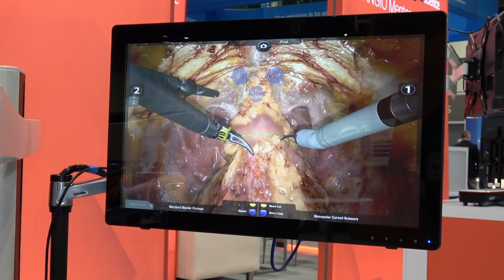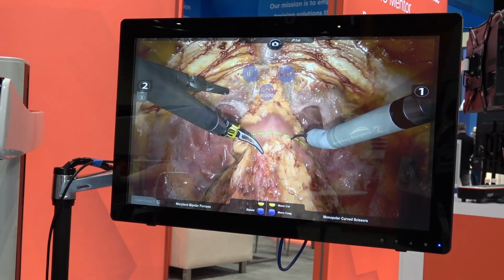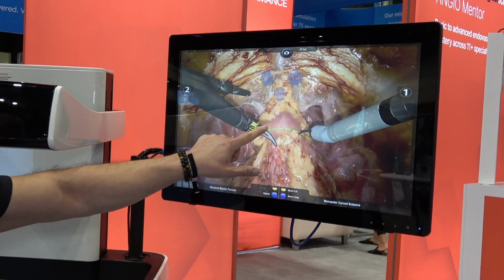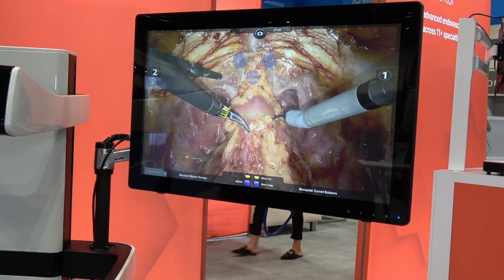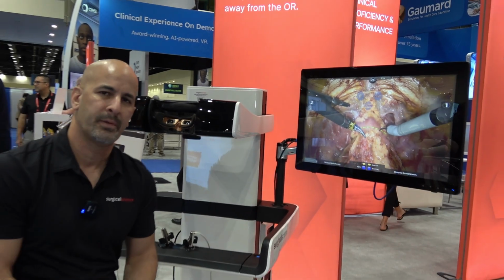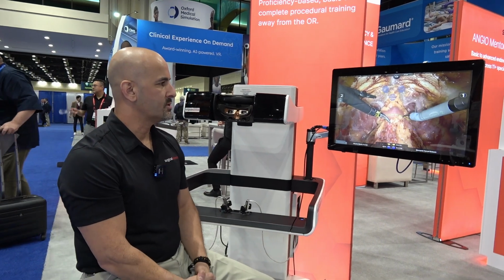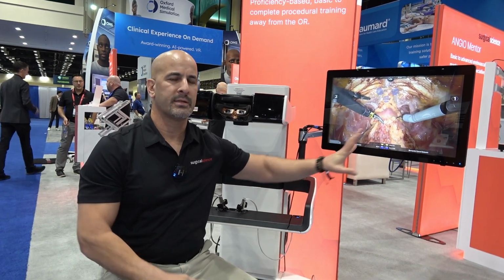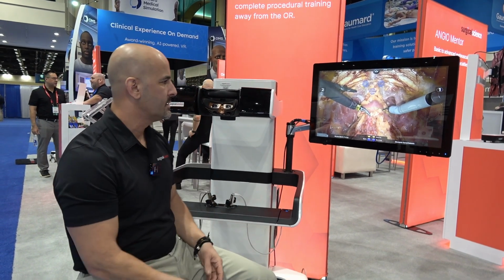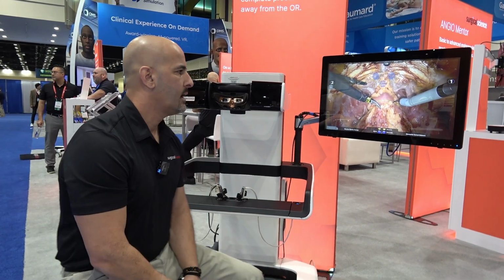In this case, prostate cancer is one of the leading cancers in the United States. What we do is teach them the anatomy exactly, using visual cues and educational aids, how to get accustomed to the robotic environment, because this is a much more complex system than open surgery or the minimally invasive procedures that we use today. This allows them to practice all the robotic surgical skills, from handling the camera, clutches, and depth perception, and of course understanding the difference between open surgery, robotic surgery and laparoscopy.